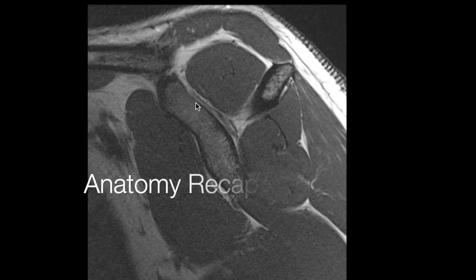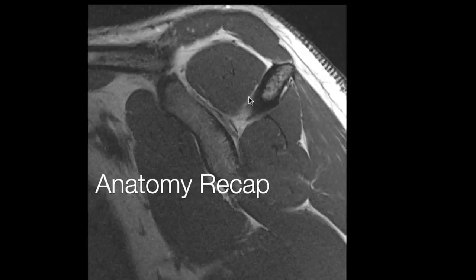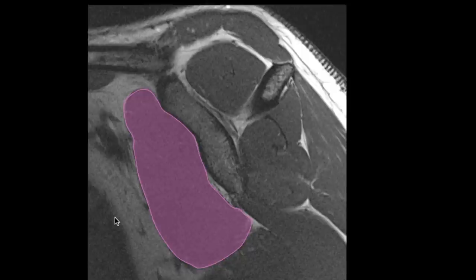This is a proton density sagittal image of the shoulder showing the four rotator cuff muscles. This is the glenoid with the coracoid process and this is the spine of the scapula, so this is anterior and this is posterior. Between the coracoid process and the spine of the scapula is the supraspinatus fossa which contains the supraspinatus muscle. Anteriorly you have the subscapularis muscle. Posteriorly there are two muscles.